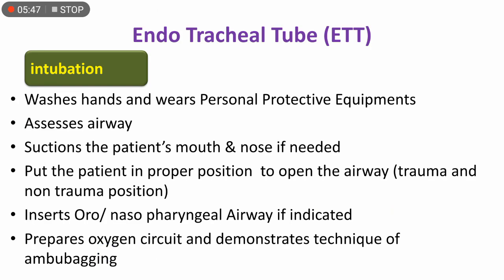Endotracheal tube. The intubation procedure is a doctor's procedure, but the nurse has an important role in it. We start by washing the hands and wearing our PPE, assessing the airway, suctioning the patient's mouth and nose if needed, and putting the patient in a proper position to open the airway. We have to consider if the patient has any spinal cord injury or trauma.